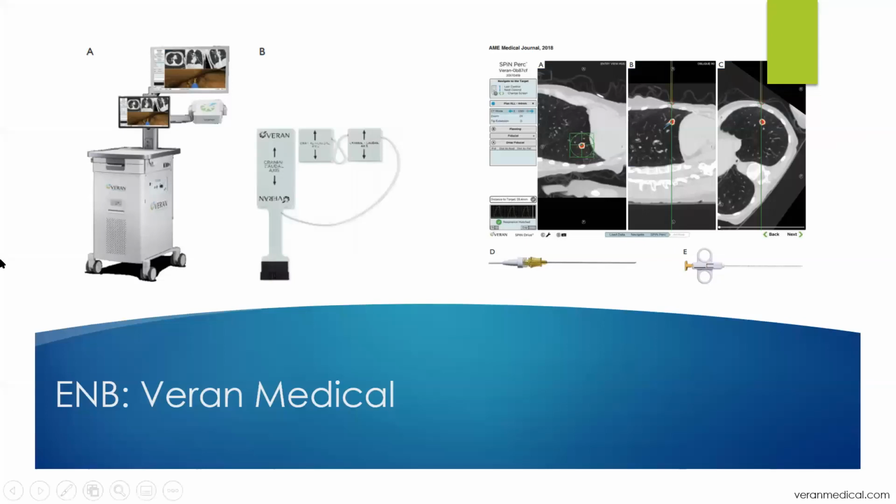This is what it looks like. A is just the platform itself. This little box here is what goes over the patient and emits the electromagnetic field. And these are the sensors that go on top of the patient's chest that can then pick up where those sensors are moving within that field.